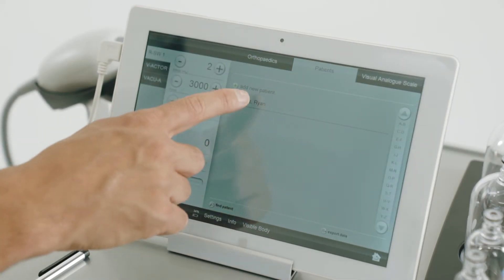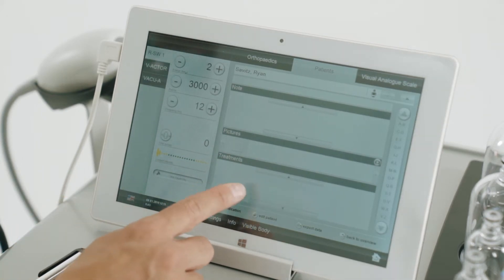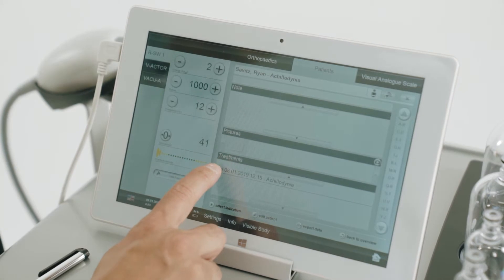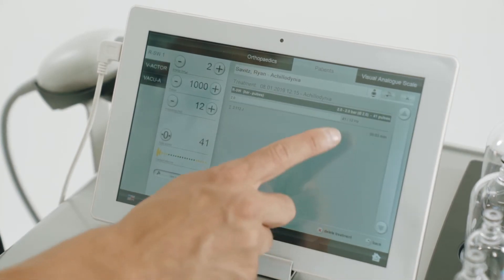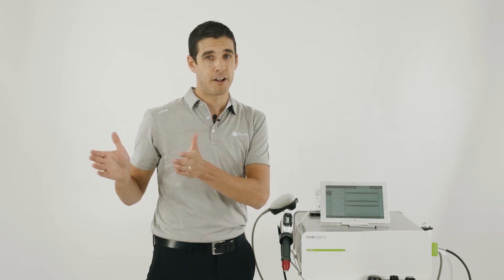The machine allows you to save patient data onto the tablet, including treatment notes and other information. The most important feature is that it actually saves the exact amount of dosage delivered to that patient during the treatment, and this can be replicated on the follow-up treatment.